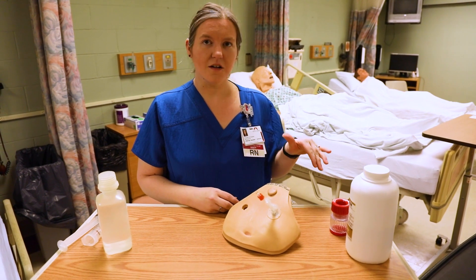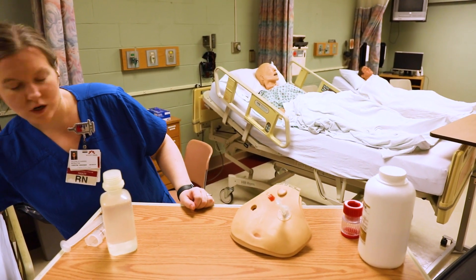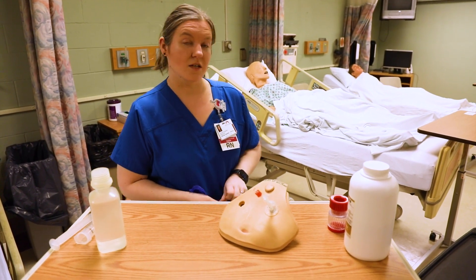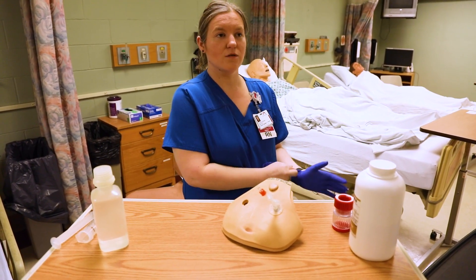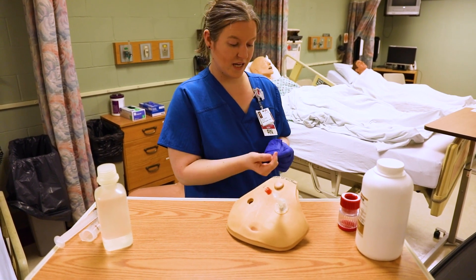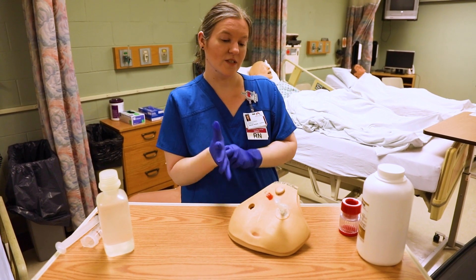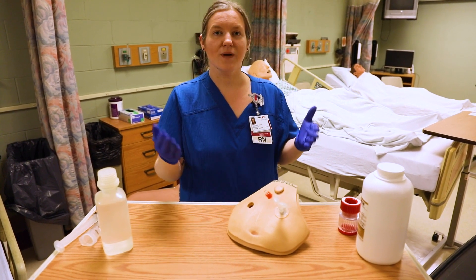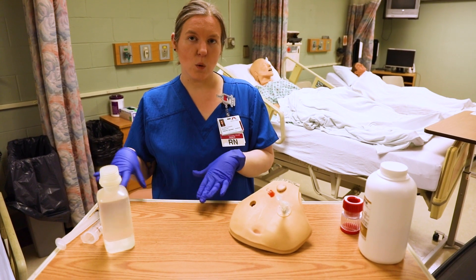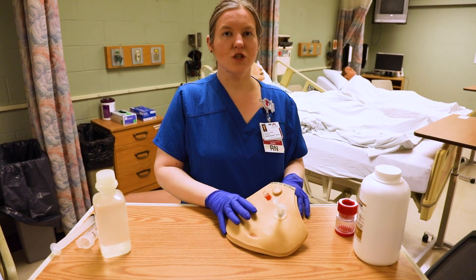We're going to cover a case where the doctor ordered both a pill and a liquid. Whenever you're doing medication, you need to do your Six Rights of Medication: that is Dr. Tim D — Right Dose, Right Route, Right Time, Right Individual or Patient, Right Medication, and Right Documentation. You always have to verify your patient's name, date of birth, medication, and check your order.